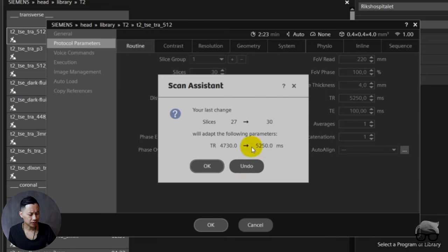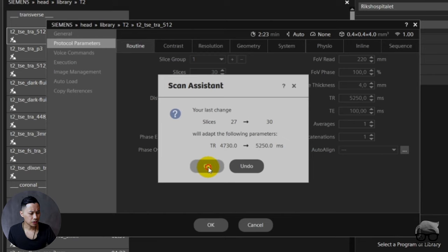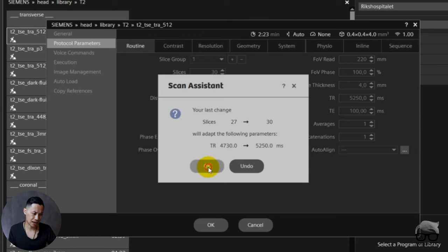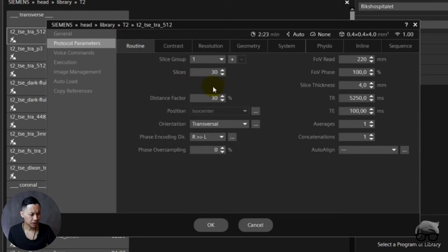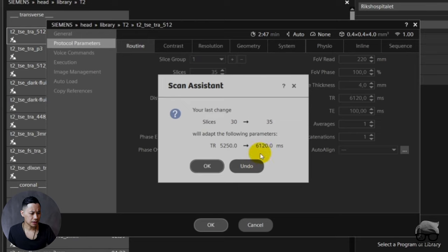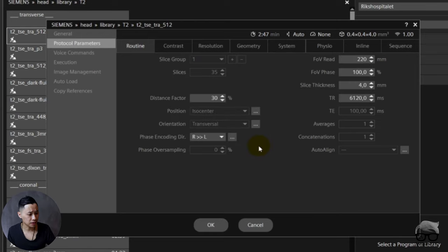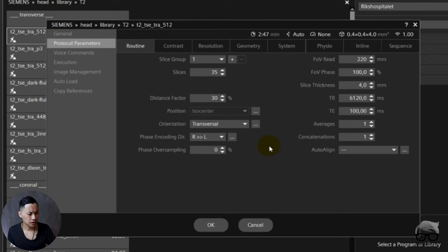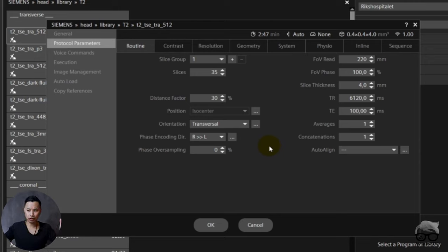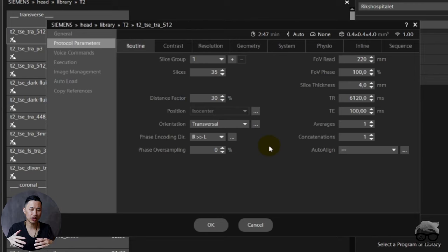It's okay for T2 because you're still in the weighting of the T2. Remember that the range of the TR is also important for the weighting that you want to have. But also remember, increasing from this TR to a higher TR also increases the scan time. But let's now say that we increase this to 35 slices. And suddenly now I have to go up to 6120 TR.